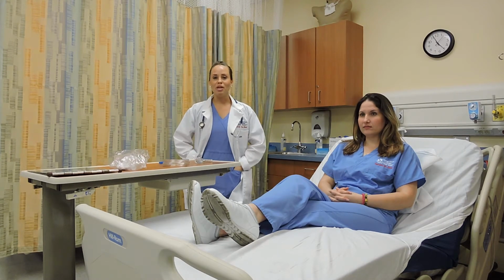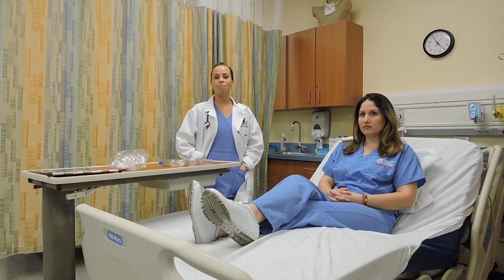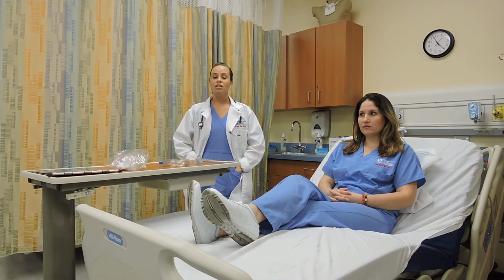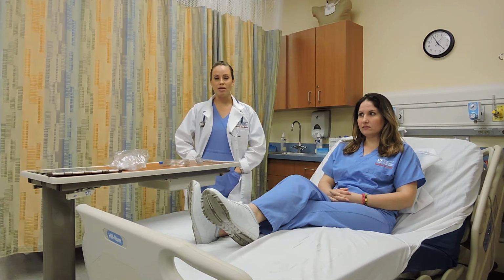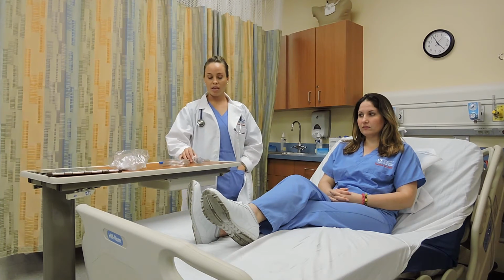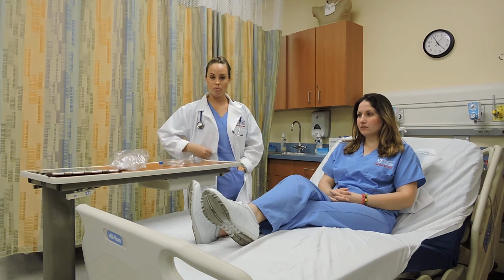Hi, my name is Maria Perez-Rojas and I'm a respiratory therapy student at Miami-Dade College Medical Campus Center. Today's topic is going to be about PAP as an adjunct of bronchial hygiene therapy, and the equipment I'll be using today is called EzPap. PAP stands for positive airway pressure.